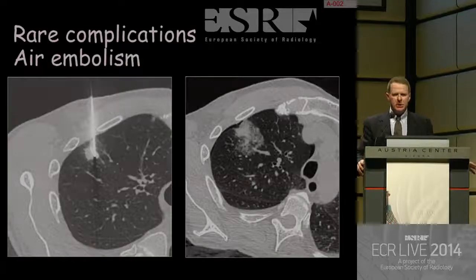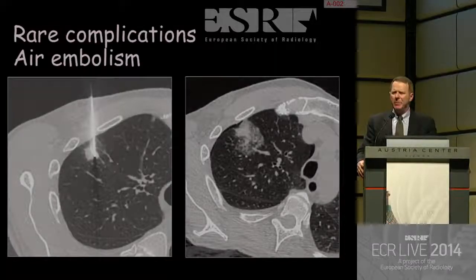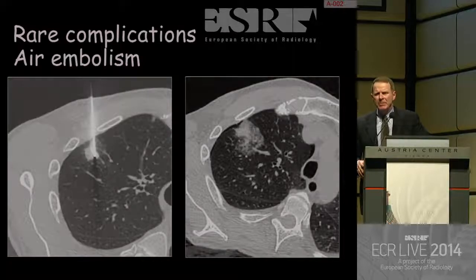A rare complication that I am mentioning here because it will really scare you to death when you have that kind of complication: has anybody in this room had an air embolism? One. How did you feel?